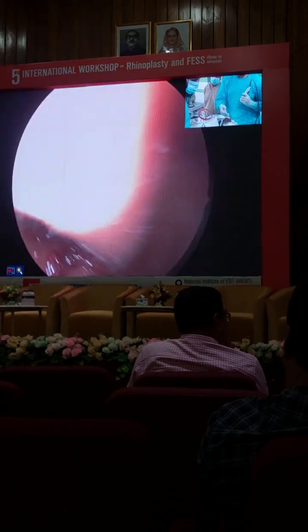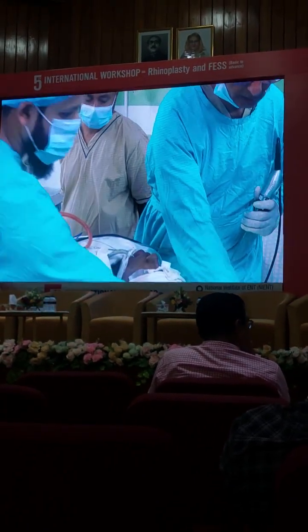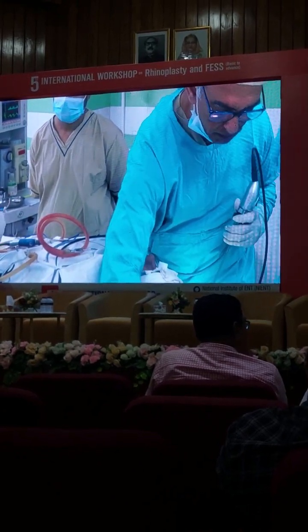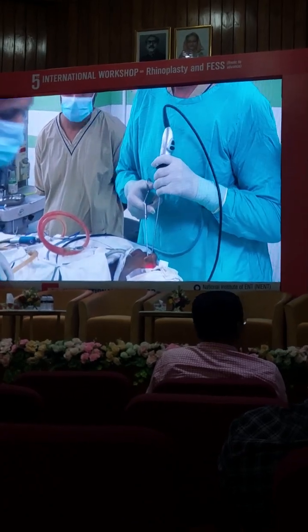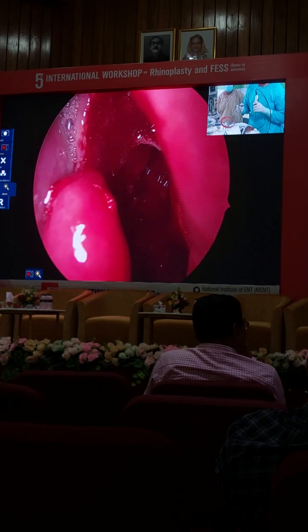These instruments, you can just keep them in front of you. We need two instruments most of the time. Keep this right in front. So we'll just take out whatever loose bone is there.